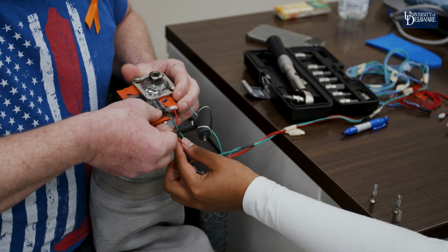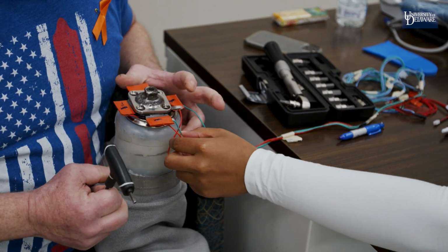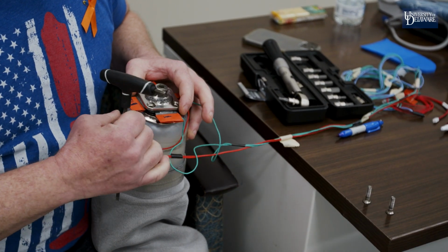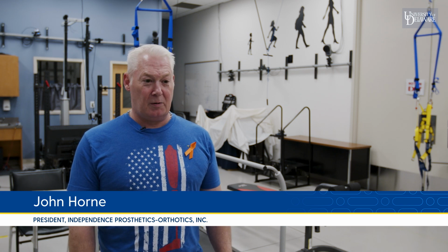Right now, the only time that they know if something's wrong is if they're in pain. So we tried to create a design using the pressure sensors created by Higginson a few years ago to see, can we apply this to the prosthetic. We're going to basically put the sensor inside of the socket, and then on the treadmill we'll be able to identify if the sensor is giving the same feedback, essentially, so that we can qualify that it's working properly.